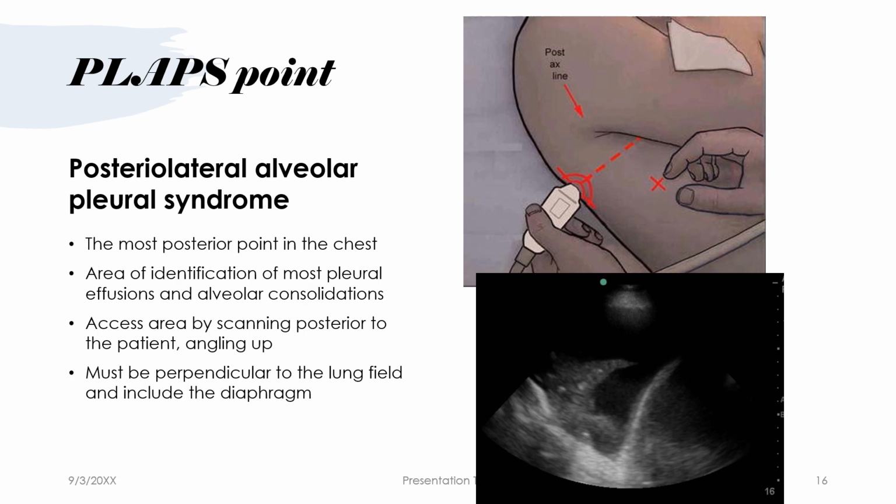When you do that, you might get something that looks a little bit like this, which would indicate a pleural effusion. Here we can see some lung waving in the wind like a sail, and then this would be all pleural effusion or hemothorax surrounding it. That is going to be the hot spot of where most things are found.